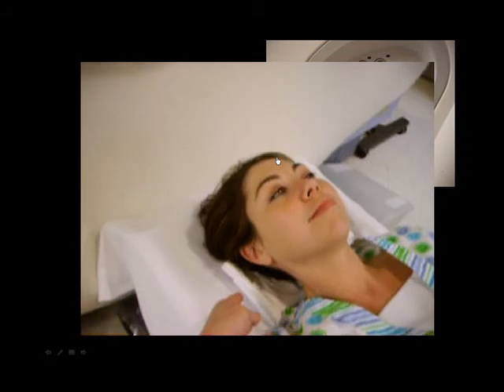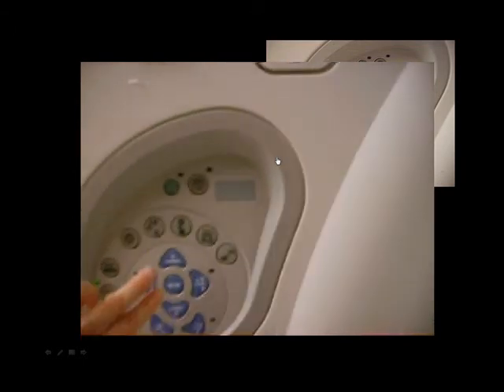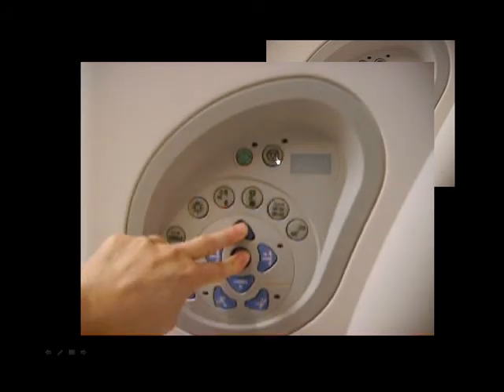Again, the patient is going to be supine, and they're going to go in head first, but you're not going to use the positioning pillow. You just want, as you could see, a little roll underneath their neck to give their neck some support. And you want the patient's arms down by their side. You may want to use the straps to give their arms support. Again, using the same buttons to move up and down and back and forth.